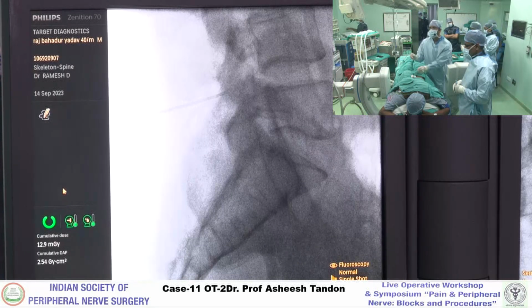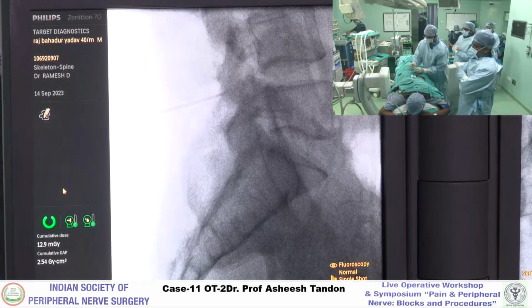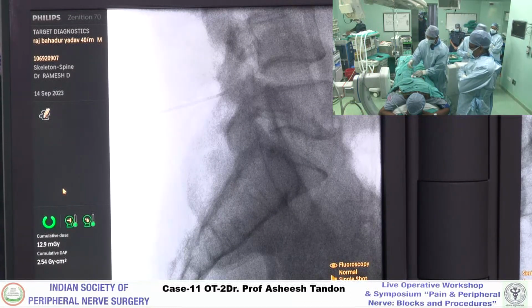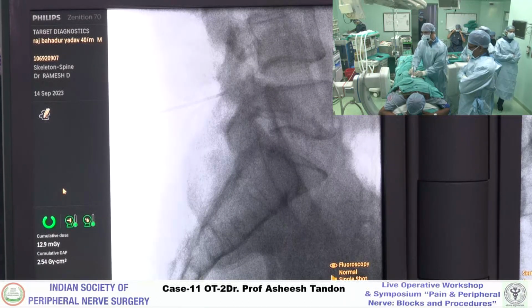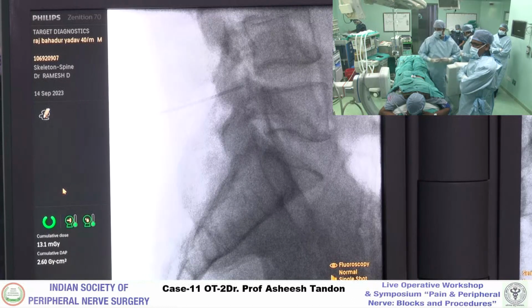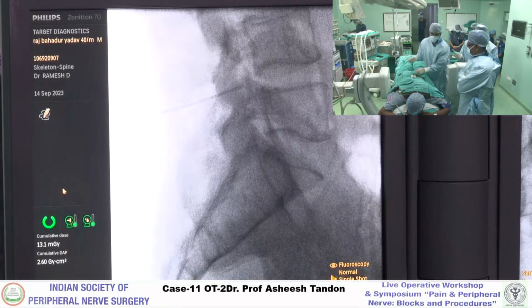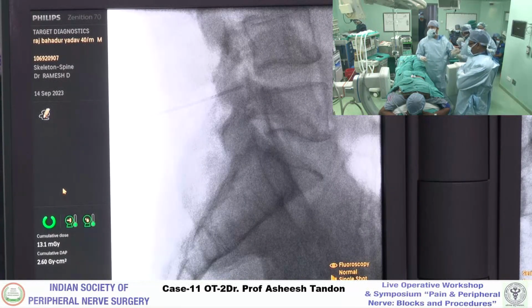Ashish, what do you think? Where we are? I'll just discuss. We have sort of repositioned. We have got it into the center. Still, yeah, now I've got it. Shoot please. Yeah, now I've got it. So bang in the midline.